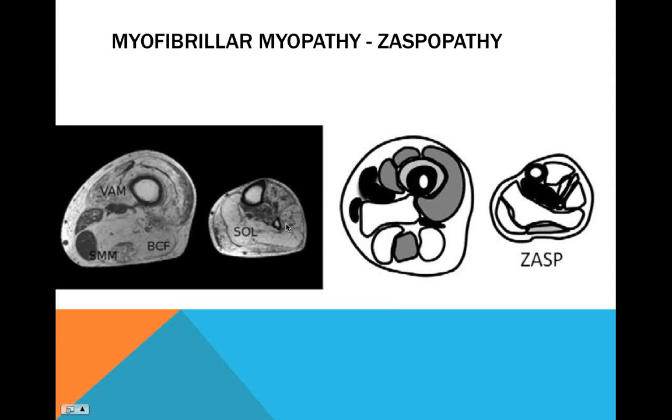The smaller the muscle fibers are in size, there's more of a density of this perimysial tissue to actual muscle tissue, if that makes any sense. Because the muscle fiber hasn't grown much, I've noticed, especially on muscle ultrasound, that there's increased echogenicity, which can sometimes correlate with myopathic changes in these kids, even if they don't have muscle disease. But I think it's related to the higher ratio of perimysial tissue to muscle fiber volume.